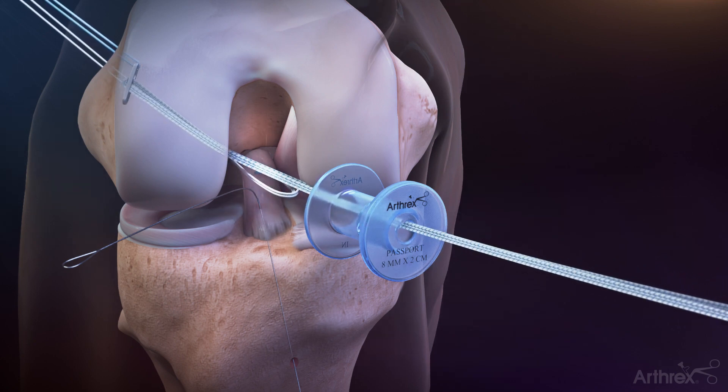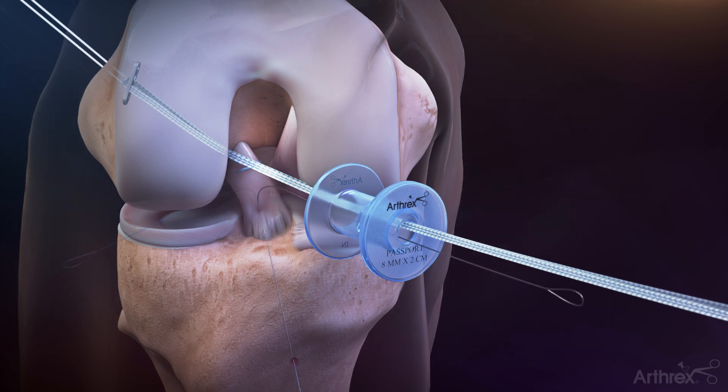Using the fiber tape in the medial passport cannula for counter tension, pull the blue tightrope passing suture to pass the tightrope button out the lateral femoral cortex. Pull the fiber tape to confirm the button has been flipped. With counter tension on the blue fiber tape, gently remove the slack in the tightrope suture by alternatingly pulling the white tensioning sutures two to three centimeters at a time.